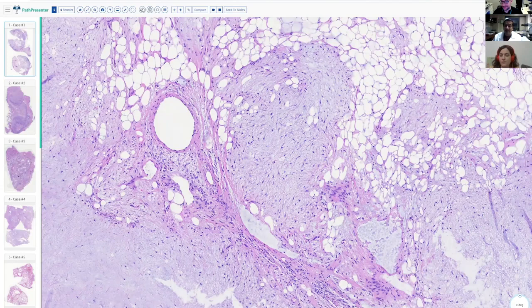In that case, the epithelium was misinterpreted as adenocarcinoma on frozen section. That was a great teaching point. I tweeted once about one that was polypoid in the bronchi and was not a solitary fibrous tumor. I ended up calling that adenofibroma, but I still don't know what it is.